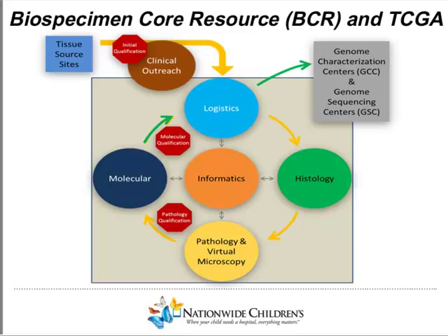If those samples do, they're brought into our facility where we have different labs that are responsible for different aspects of the pipeline, from a logistics team that coordinates the bringing samples in and distributing them to the different groups, a histology group that prepares slides and stains those slides so that they can be transferred to a virtual microscopy group where images are taken of the slide and sent out electronically for path review to confirm the diagnosis and then the percent tumor nuclei of the specific sample that we receive.